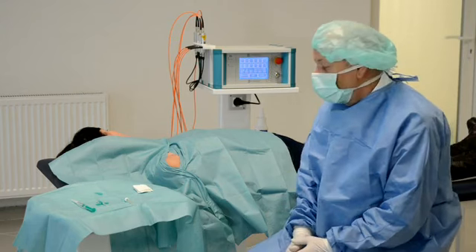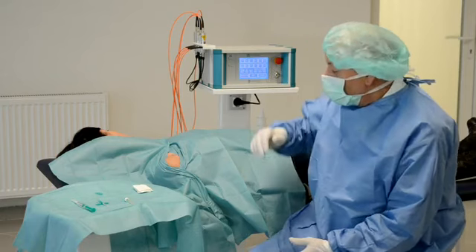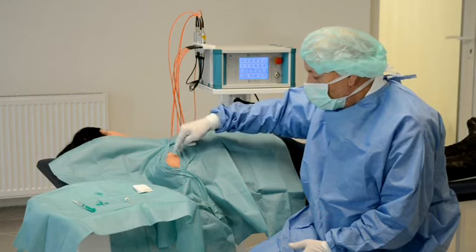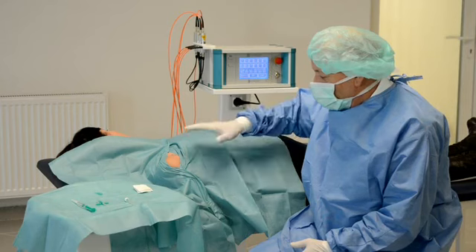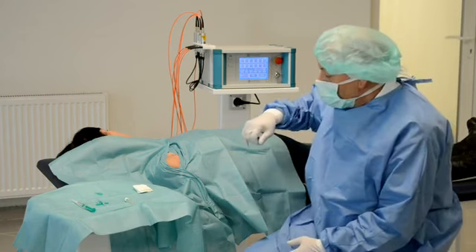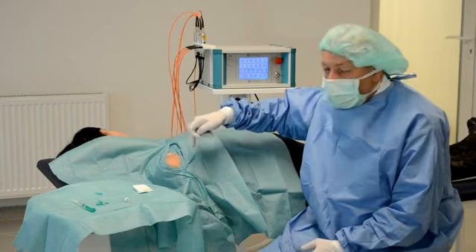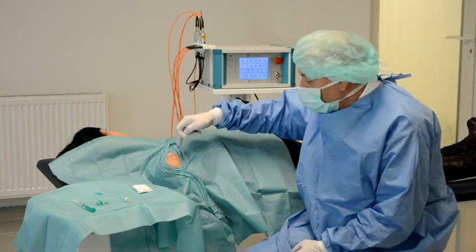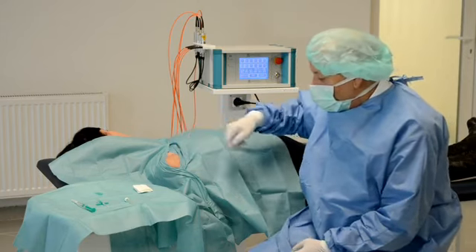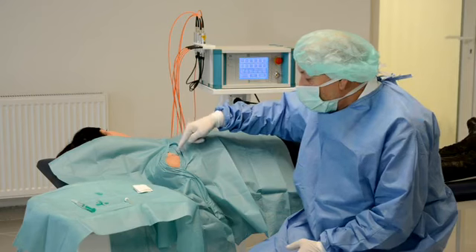Dear colleagues, I now want to show you a treatment of a chronic shoulder syndrome with interstitial laser technology. This lady has been suffering for a long time from a frozen shoulder, and you all know from your experience how difficult it is to treat this pathology. Normally we give steroid injections and other therapies like physiotherapy, but very often patients suffer for years from their problems. We have developed special equipment for this therapy.